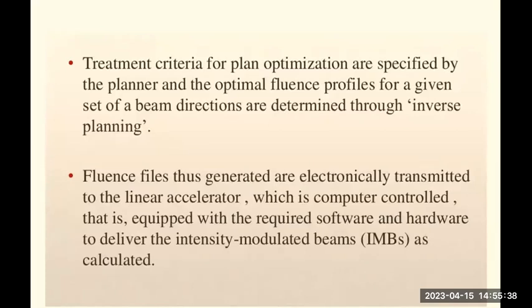This is completely computerized. That's why a biomedical engineer is required for coding and everything, because the beam distribution is very important, and manually it is very difficult. In olden days, Linacs were operated manually, but now computer control is used efficiently, so the modulated beam can be properly calculated and delivered.